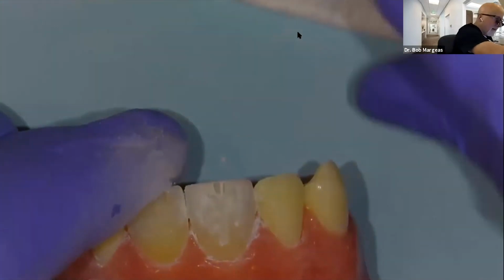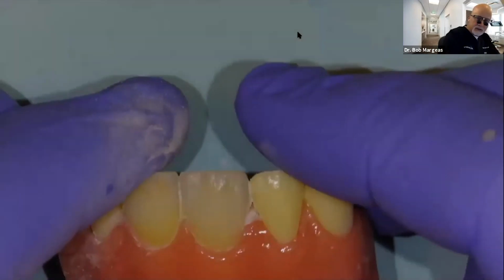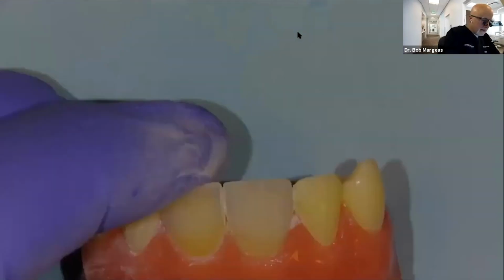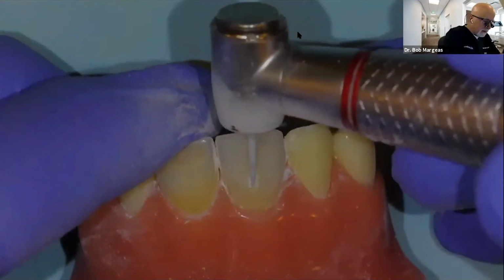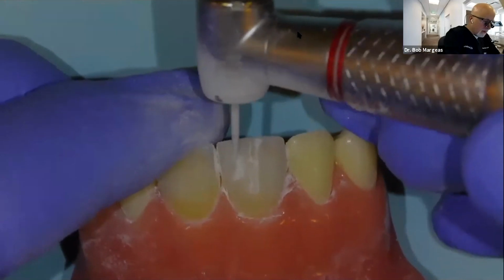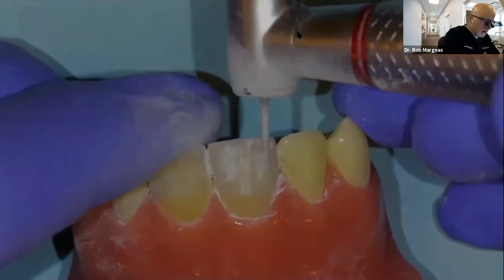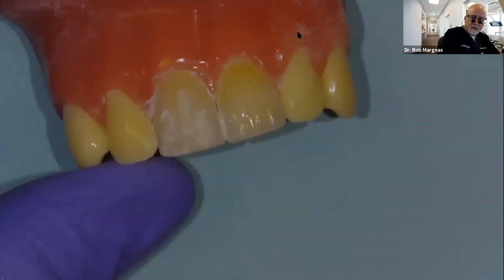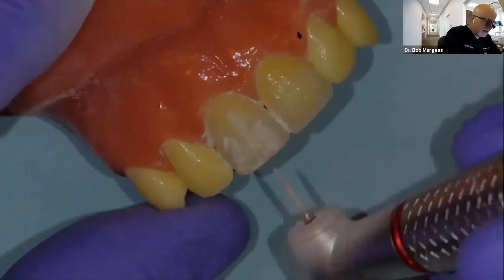Like that. And you'll start to see the anatomy of the tooth. Then what I'll do is continue this here. And then in order to create the perikymata, or the lines you see here, I draw this like this.